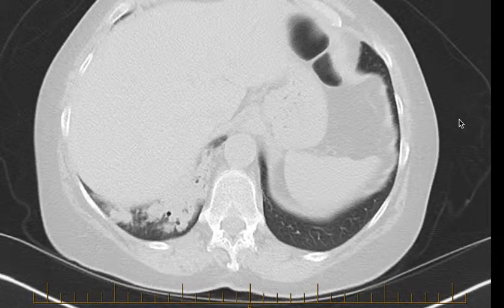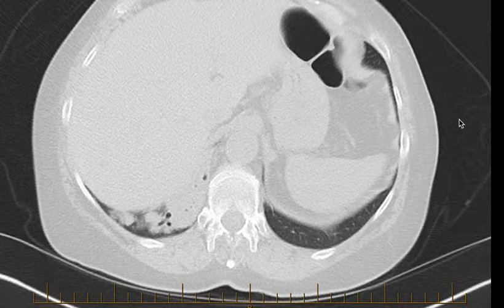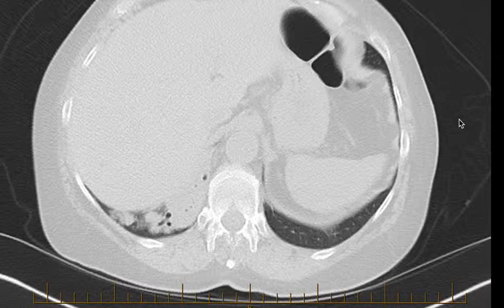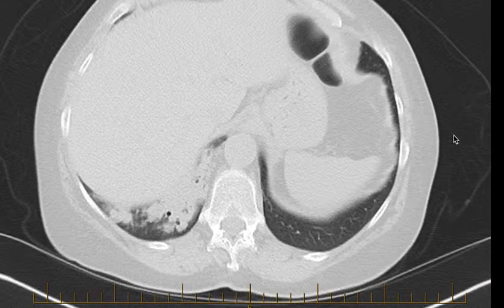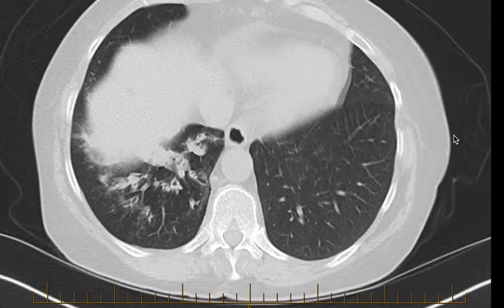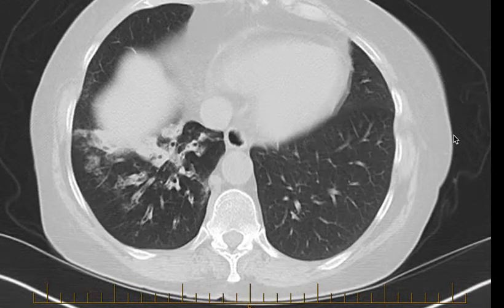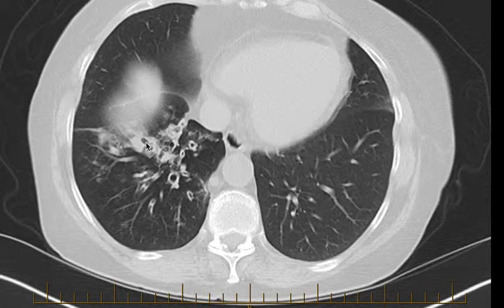Down there you can see some air bronchograms with dilated airways, but there are also airways that are impacted with mucus.